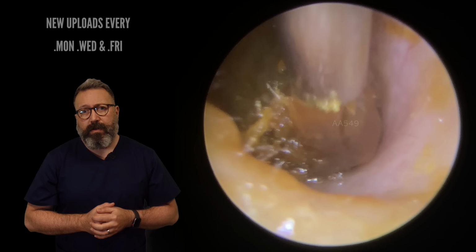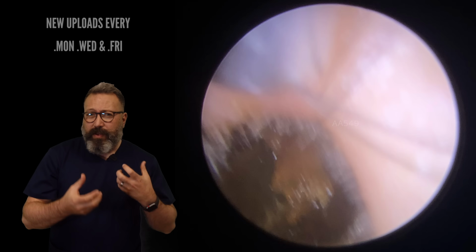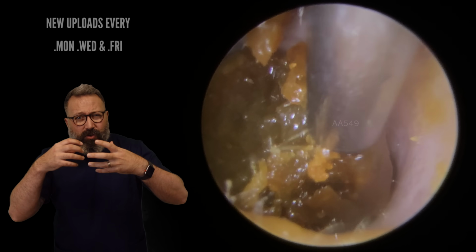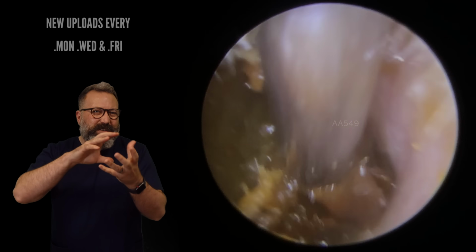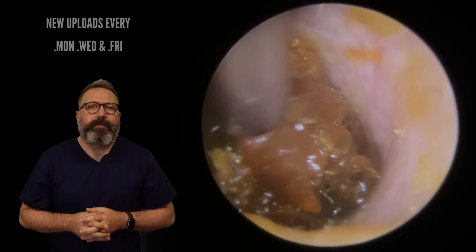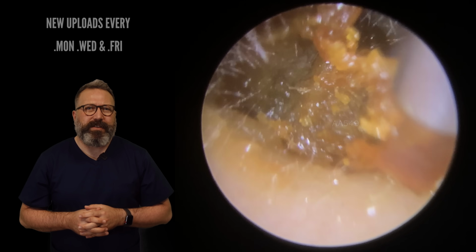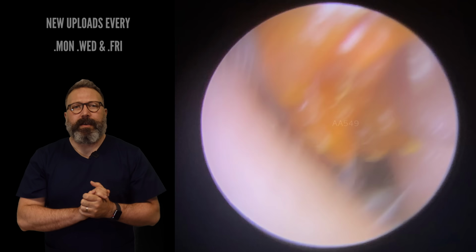There we go. But you can see it's moving, but we can see these sort of dry skin layers in there as well, which means it's not got the full range of movement of this wax I'd like it to. It's more just kind of spinning slightly. Really holding on to this. As we pull that bit of skin, you can see how it's interwoven into the rest of that plug of wax.